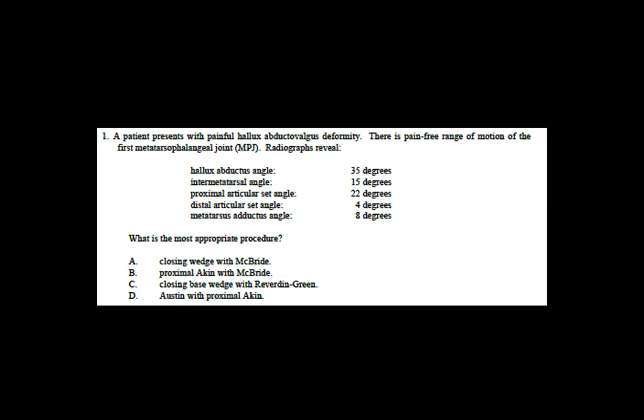And this is one way of doing it instead of giving you an actual image of just going off the angles. But I would say beyond the angles of the bunions for your board exams, people may ask you the numbers basically for academic purposes, or if you're on an externship, just to see if you know them.